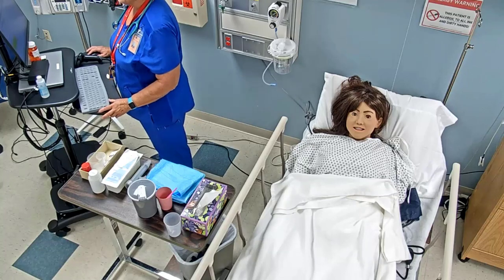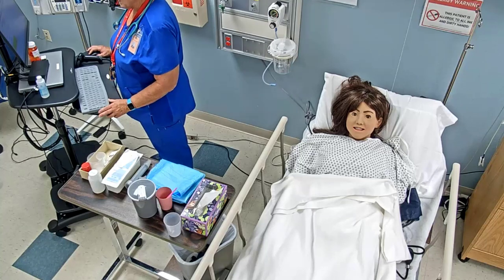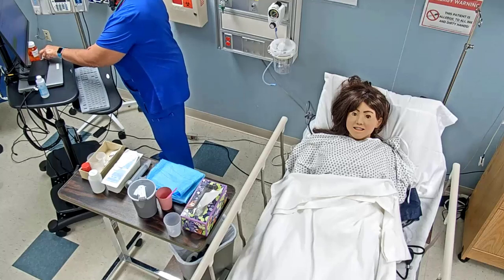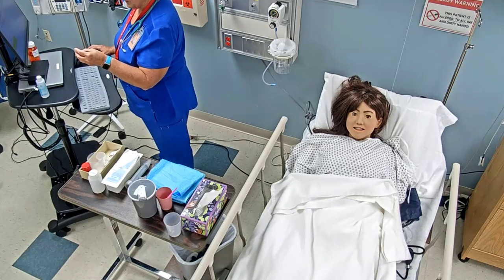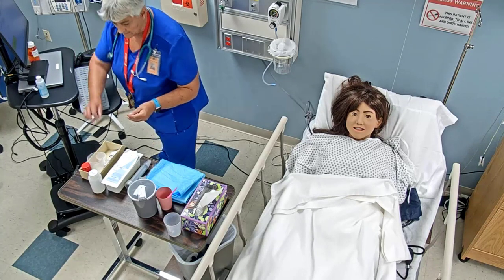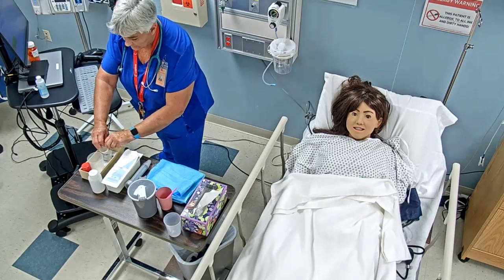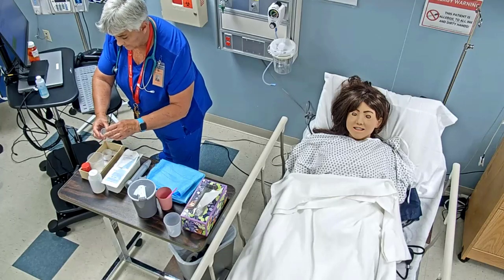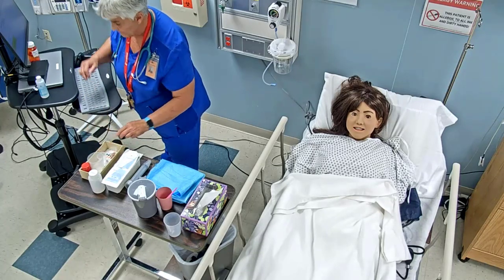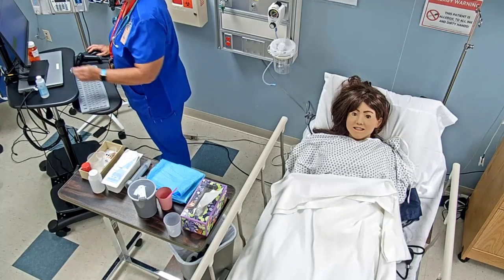So I've got Anna Taylor, date of birth 4/24/1991, no known drug allergies. Metoprolol 100 milligrams daily per peg tube at 9 o'clock. And I have metoprolol 100 milligrams, expiration 2/20/25. And again, it's intact, and so I'm going to put it in, because I'll be mixing it with, once I crush it, 30 mils of water, okay? And I've got a couple of extras here for waters, and that's my second check on that.